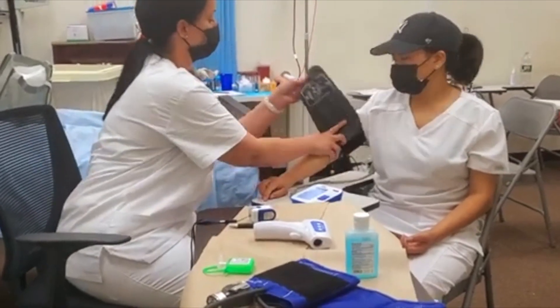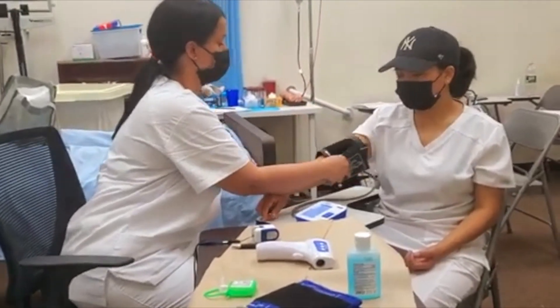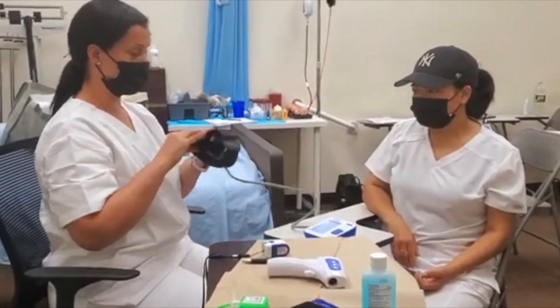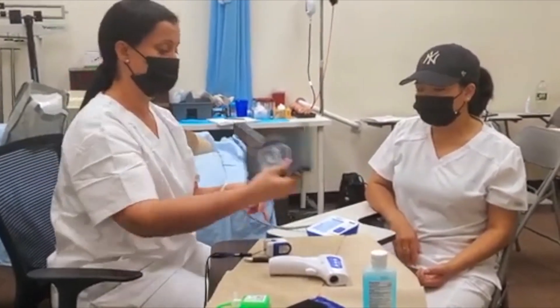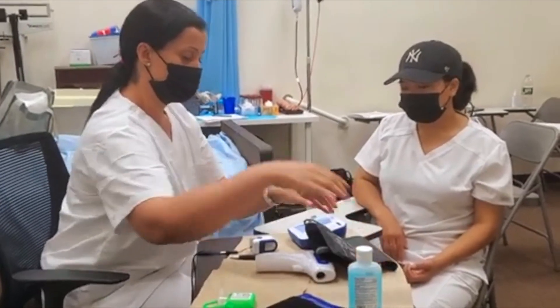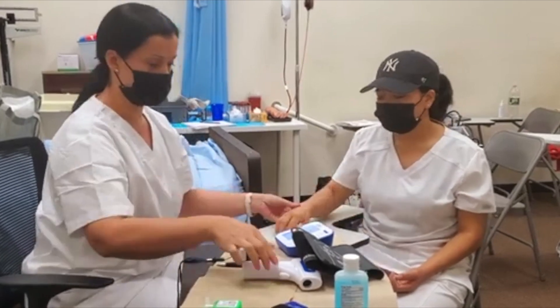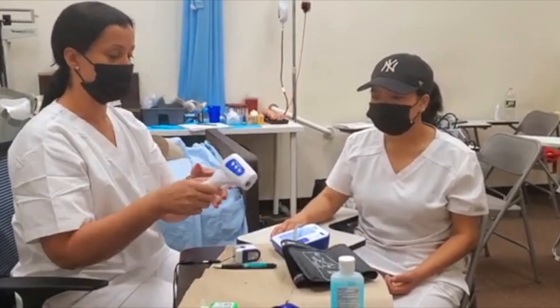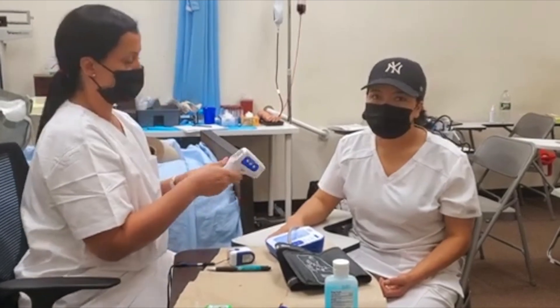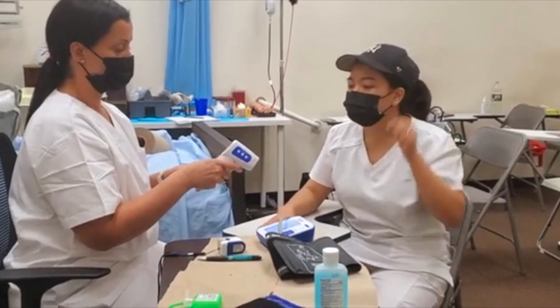We're going to document that — we're going to pretend we're documenting all these findings. We're going to disinfect everything, okay. Now we're going to do her temperature. Like always, we wash our hands, we disinfect everything. I'm going to do your forehead.